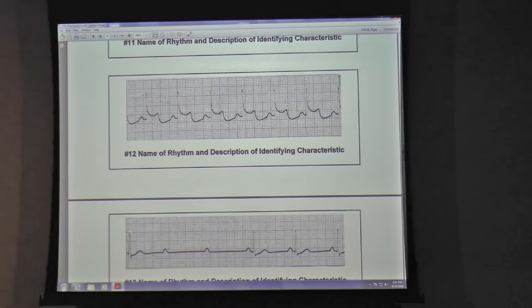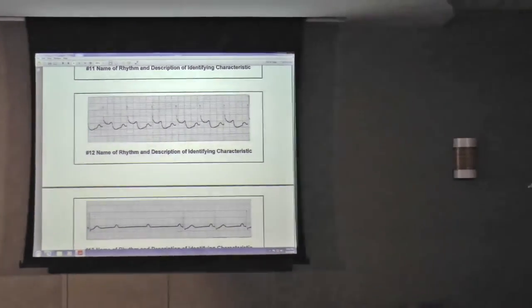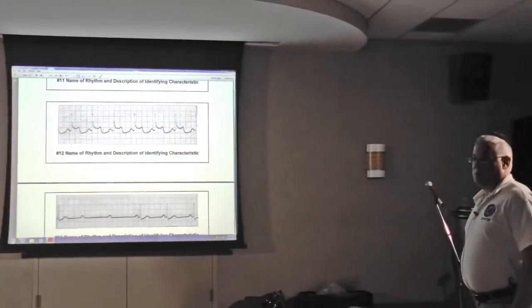But the thing that would strike us here is you could see the S wave doesn't come all the way down. It meets the T wave, doesn't come down to the isoelectric line. So again, if this guy was saying to us, I don't feel well, I got nausea, I got chest pain, I got shortness of breath, I got abdominal discomfort, and he was in this rhythm, he would be worthy of a 12 lead, probably worthy of giving some aspirin just to be on the safe side.